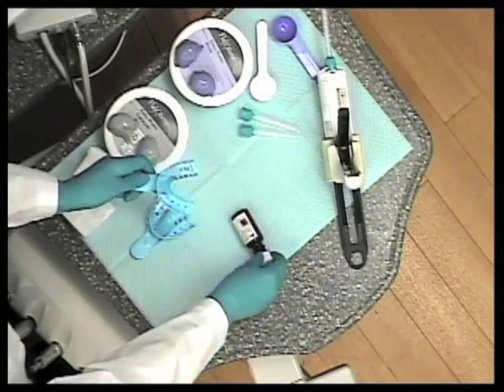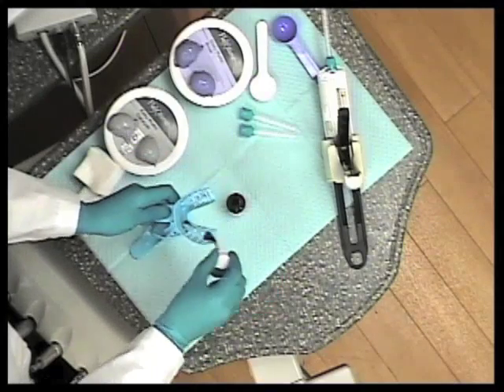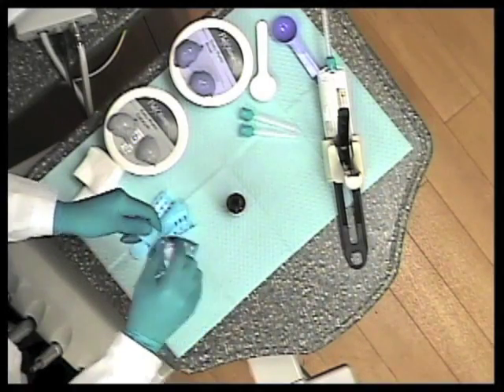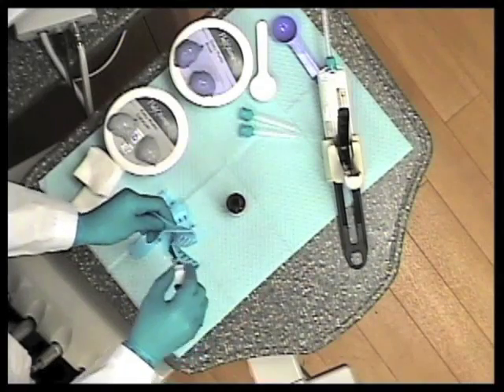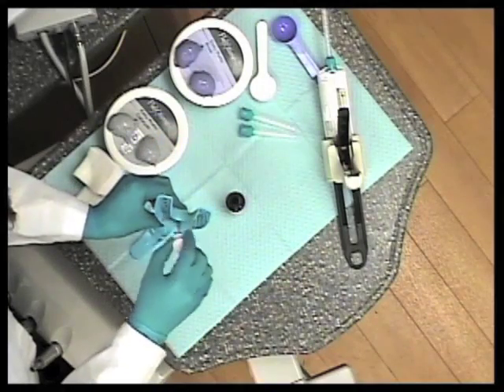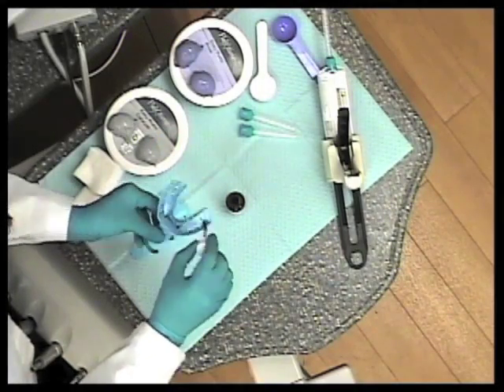Just be sure, there's lots of different adhesives out here. One of the mistakes we occasionally see is an assistant or a doctor using an alginate adhesive for a polyvinyl. So this is an adhesive you're going to use just like you would use for a crown and bridge type impression.